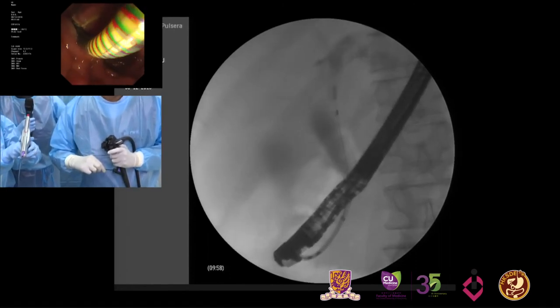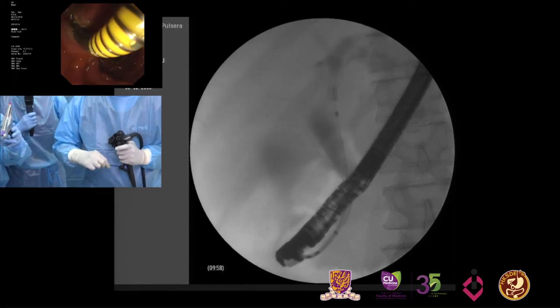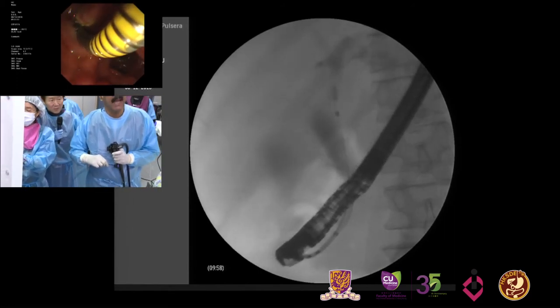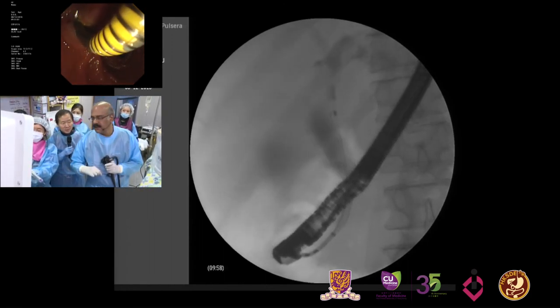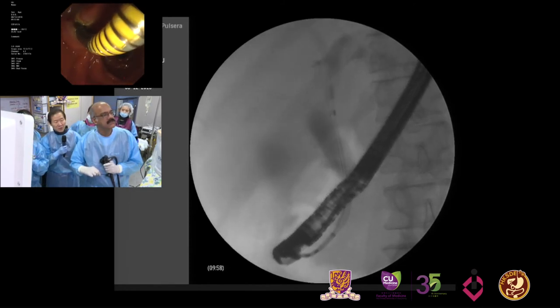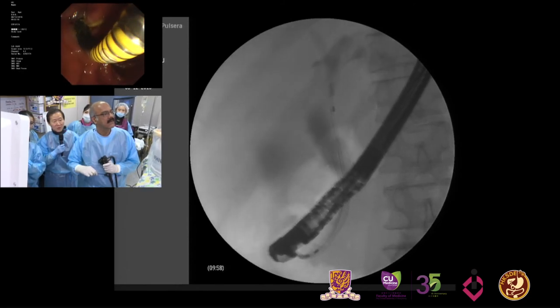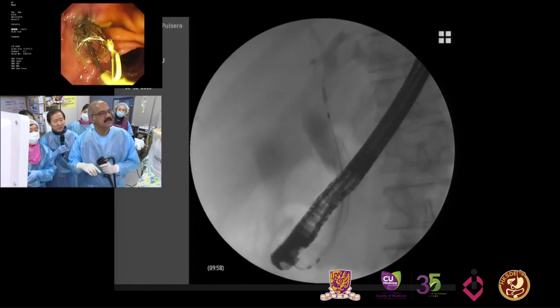Keep going. As soon as we come to a point of no return, tell me, Esther, then we'll remove the back. Yes, this is the point of no return. See that on the camera? She's going to take out the safety valve on the back, and then we are going to fire the gun completely. Now shoot. Okay, you can see now. Very nice. It's got a nice lasso there, you can see.